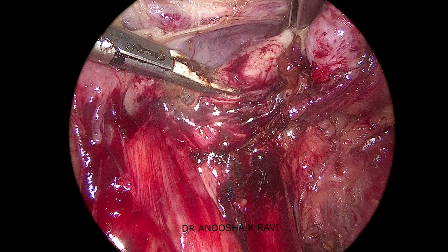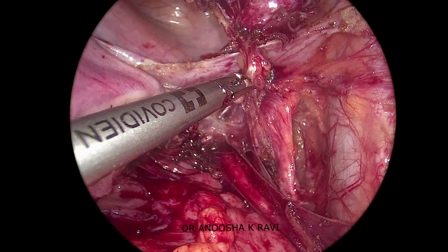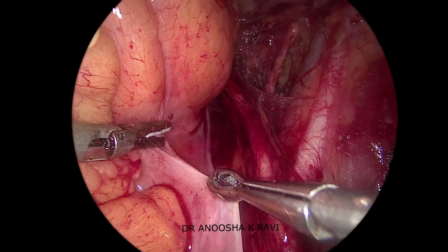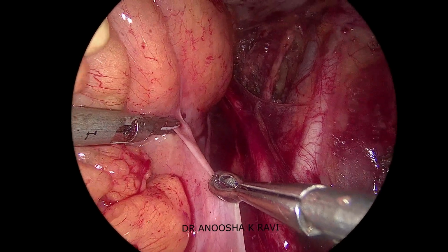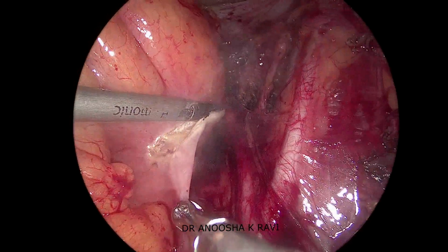Now right adnexectomy is done. Both-sided ovaries and tubes are removed in this case. One can visualize both-sided ureters in their entire course. Now dissection is proceeded in the medial pararectal space. Rectal fat marks the safety margin to guard rectum.